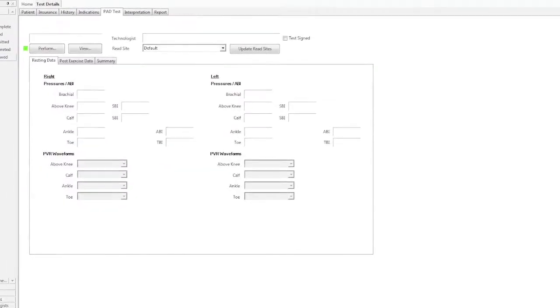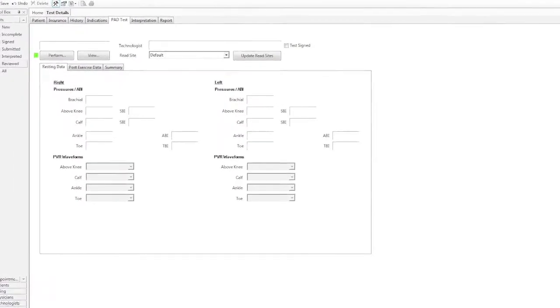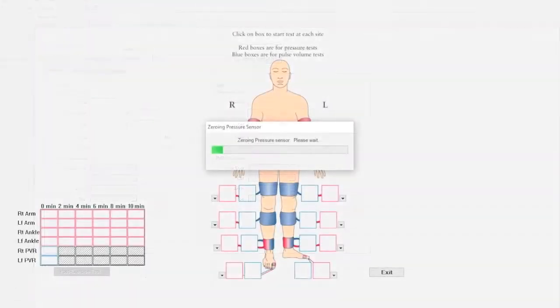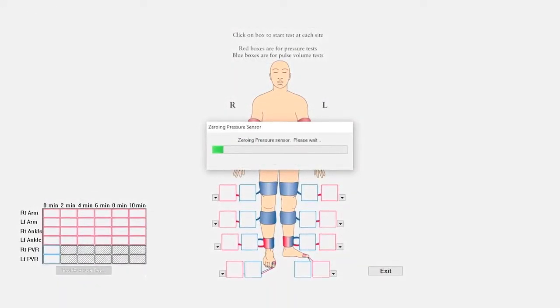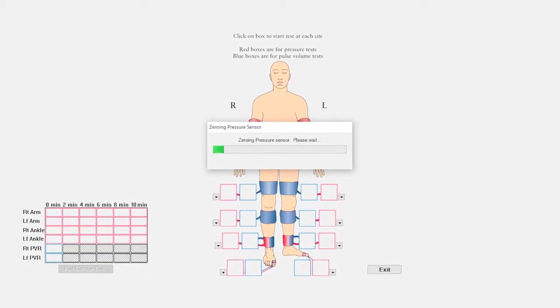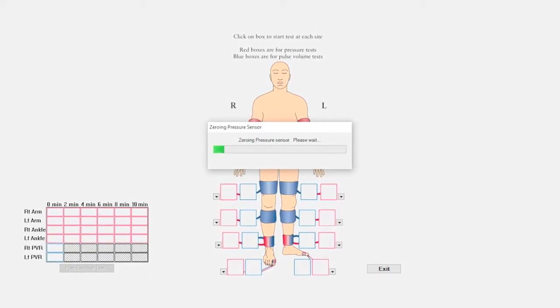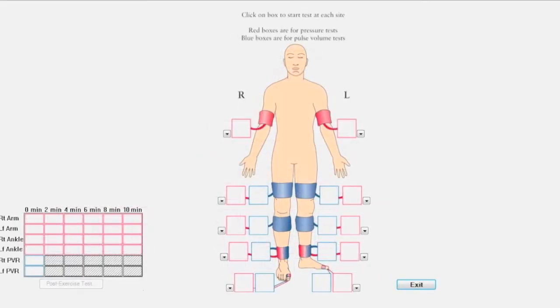Click the Test tab and then the Perform button to begin the test. Follow on-screen instructions for cuff connections and zeroing if necessary. You'll start from the arterial test summary screen.